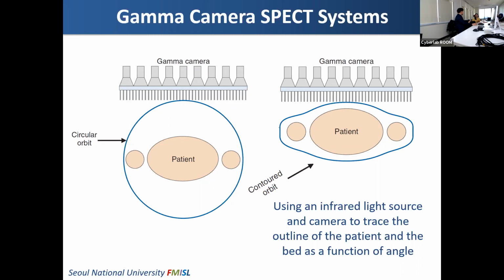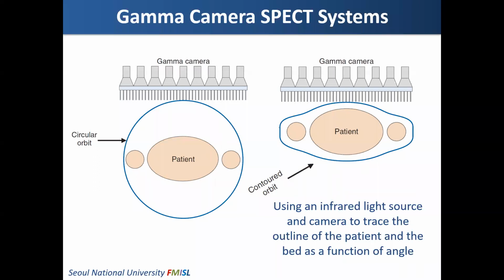For the multi-pinhole collimator, is it also used for humans? I have never seen it in the GE or Siemens SPECT, but maybe someone showed me a multi-pinhole collimator for the human brain, but I don't know whether they have commercialized it or not. Another company, MI Labs, also developed a brain-dedicated SPECT based on a multi-pinhole collimator. So there is some possibility that it will be used in clinical SPECT systems.